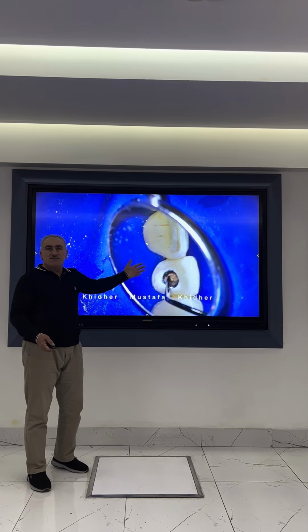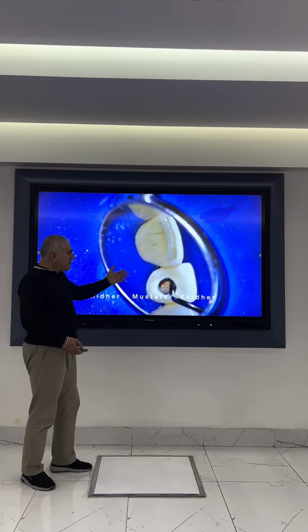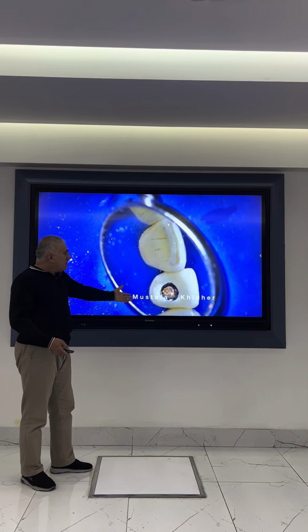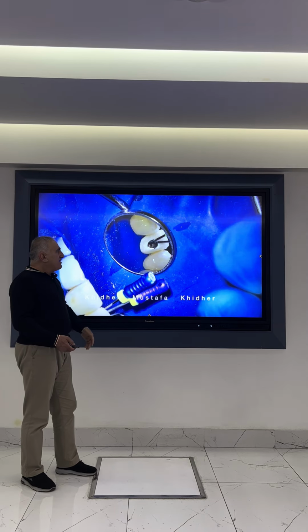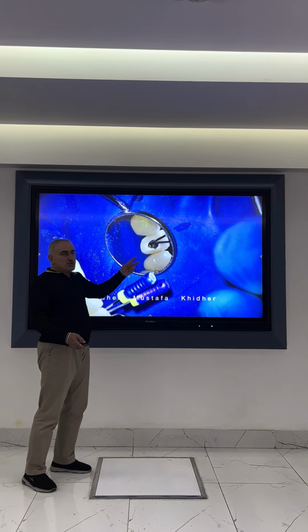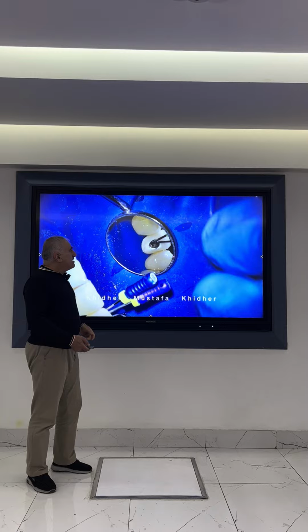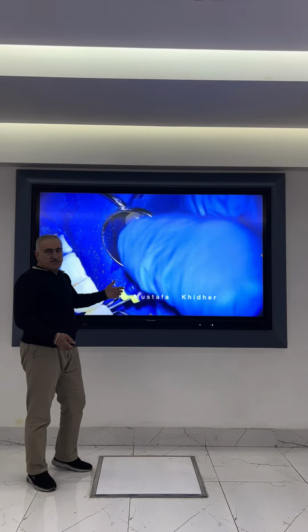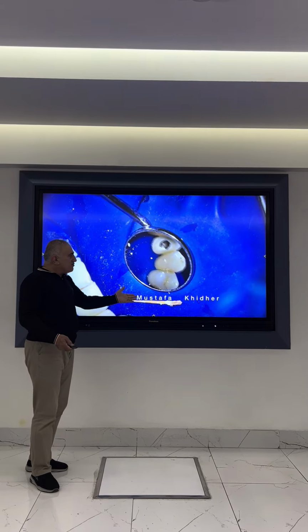By the way, all these videos are directly from the clinic without any adding, editing or acceleration. So it's real time in our clinics. I see that the guttapercha is moved and the pus is discharged around it. So I choose an H-file to grasp the guttapercha and remove it. This is mostly used with most cases, especially those that have a space around. So I remove the guttapercha.